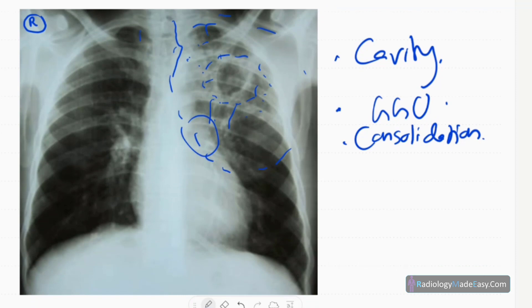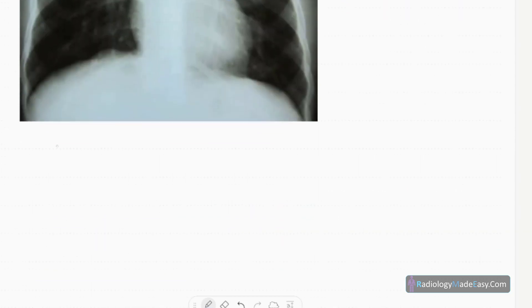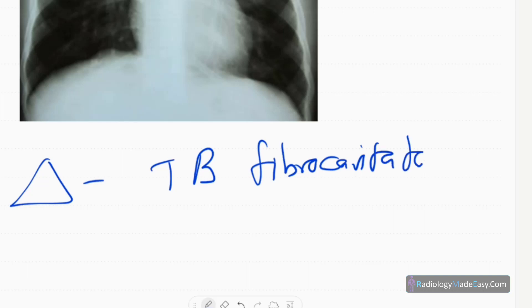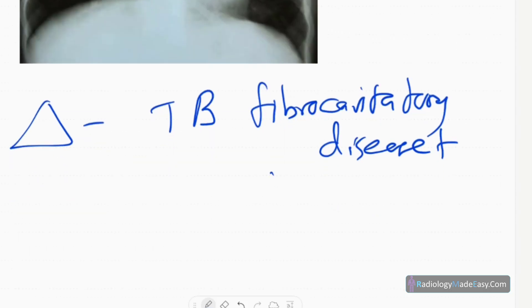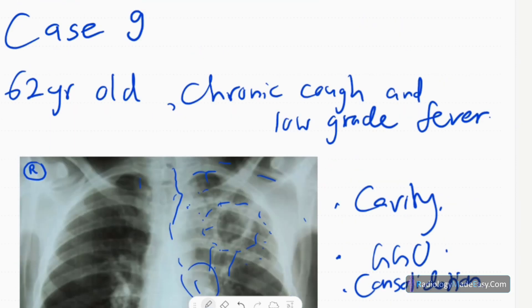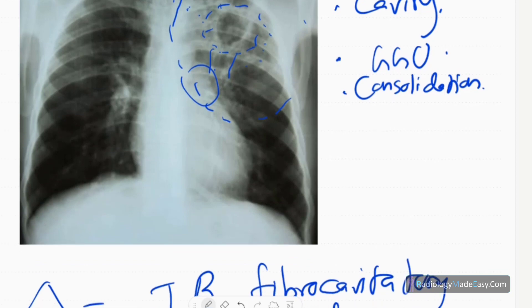The underlying bones are also normal with no significant elevation of the diaphragms. The diagnosis in this case is TB fibrocavitary disease with active infection — also known as post-primary TB with active infection — because there are consolidations suggesting active infection, and the cavity is a post-primary TB presentation.